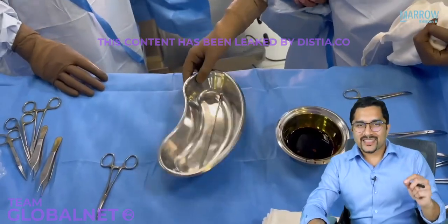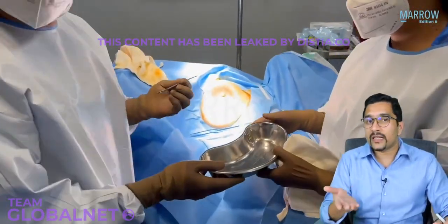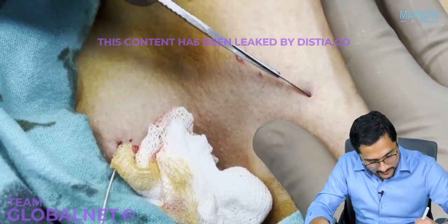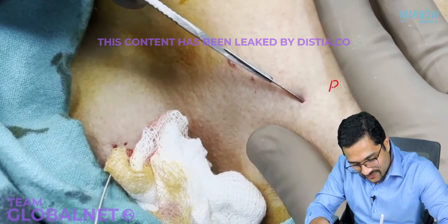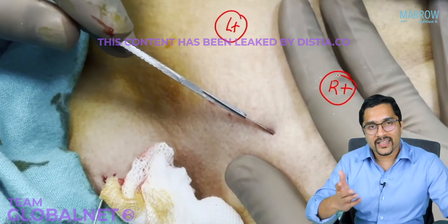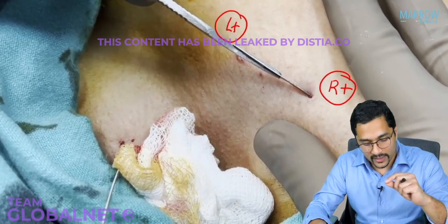In this video, you can see that the nurse is handing me the blade, and I told you it is always handed in a kidney tray so that I don't get an injury. Once I have the BP handle in my hand, I'm going to make an incision. You can see here that I'm the left-handed surgeon, and this is my right and this is my left. So when I make the incision, I'm going to go from my right to my left.